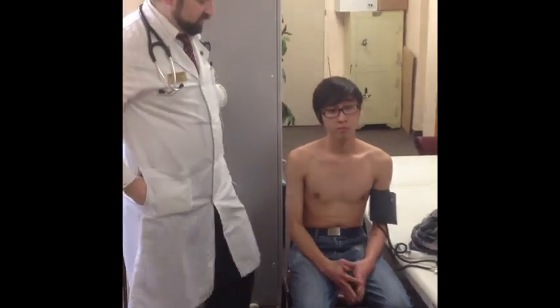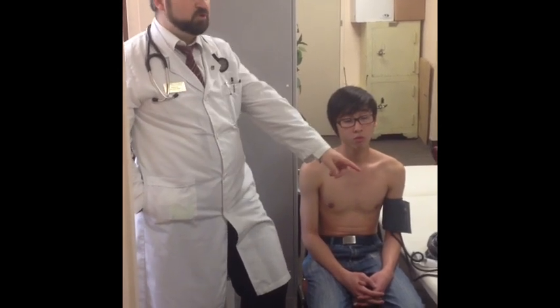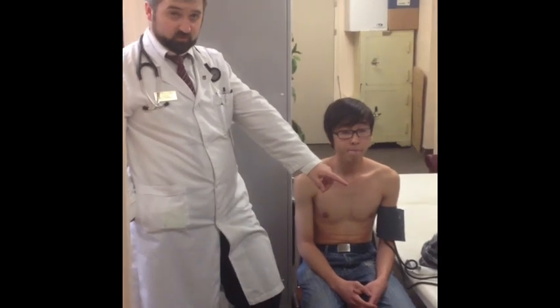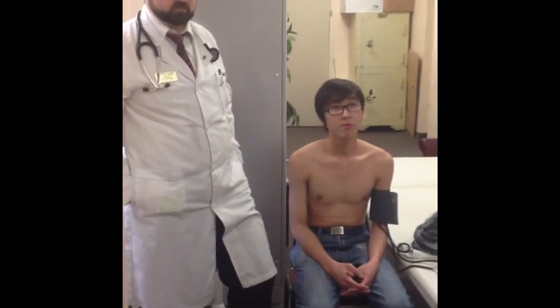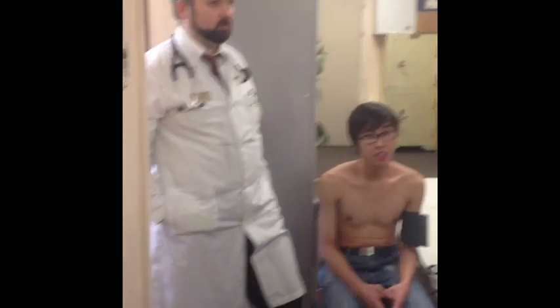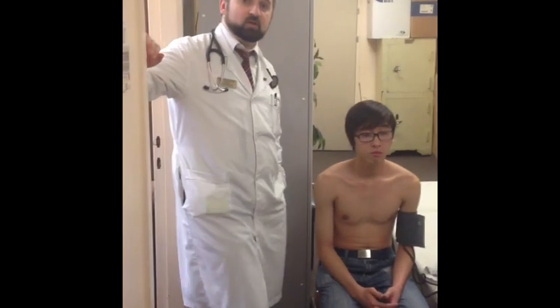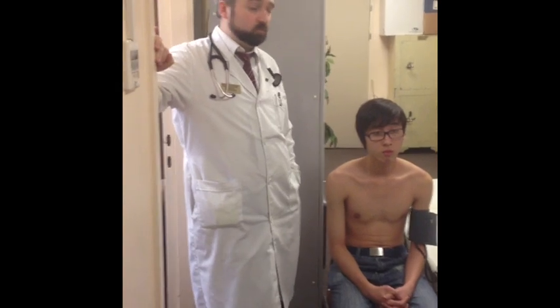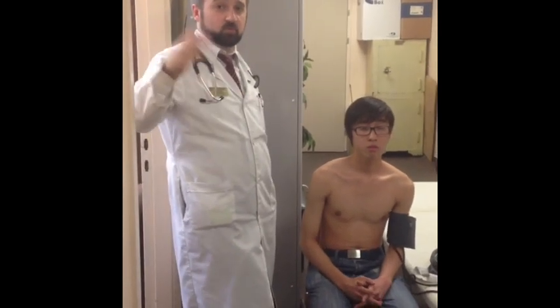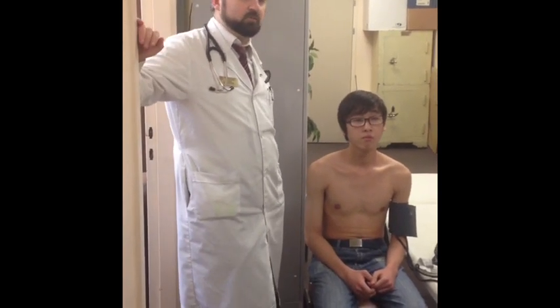The blood pressure reading is 112 over 74. Please remember that there are no odd values — only even values. So if you say 125 over 75, you are incorrect. Only even values are valid. Modern automatic digital devices also measure with even values, and these traditional devices only have even values — no odd values.